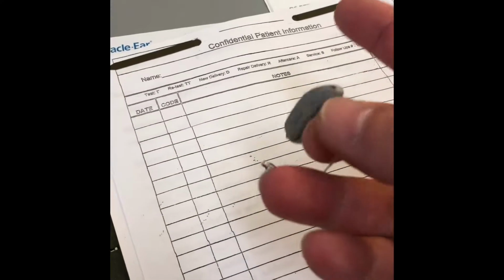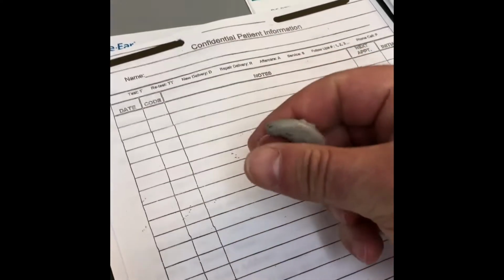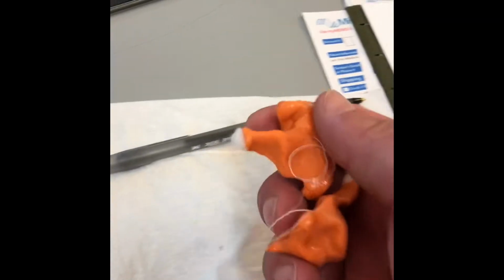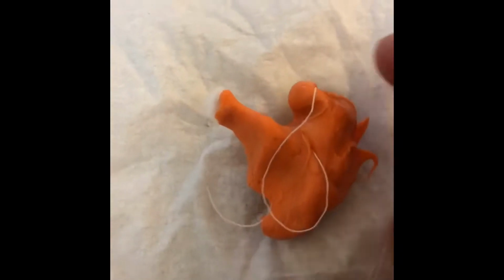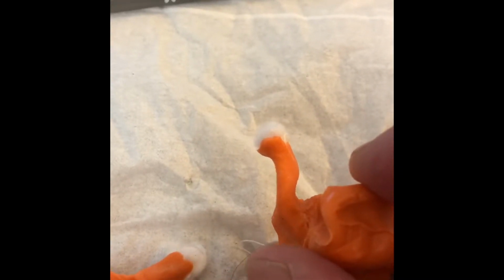The other problem is she's very, very active, and they keep falling off the top of her ear. She's going to lose them, and yes, I did just sign her up for the protection plan. Here are her ears. We took impressions of her ears because we're going to make a custom mold. But look how thin that is.